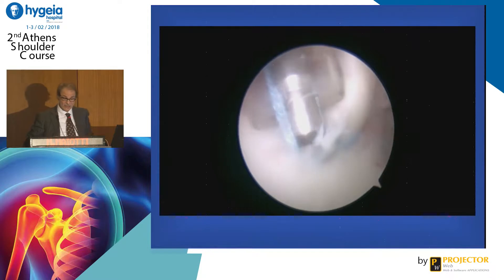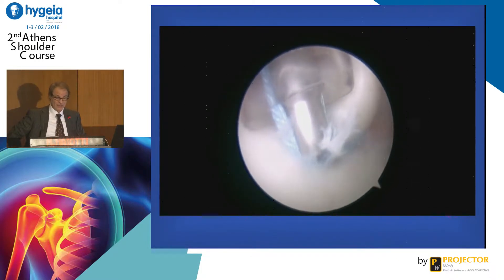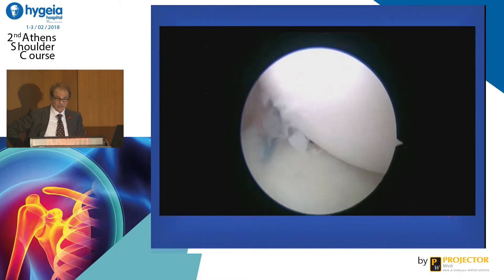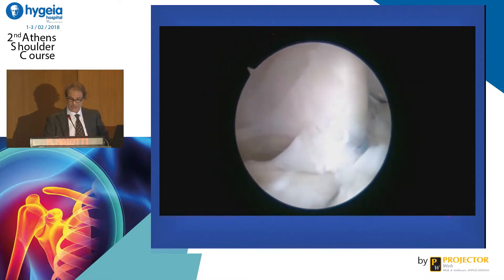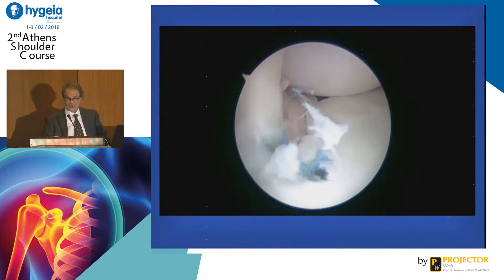The arm should stay in neutral rotation or slightly external rotation. Then you can see that you have reinforced the capsule and achieved recentering of the humeral head — so it's a push effect of the head posteriorly.